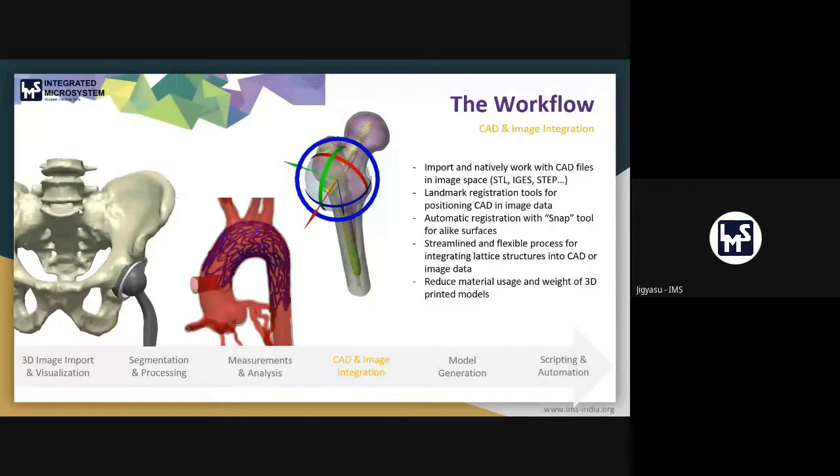Another very helpful thing is we can also design implants using third-party tools like SolidWorks in this part itself. So we can export our anatomy, let's say, taking the example of this pelvic structure. We can export this complete model to SolidWorks, and then I have the actual measurements or actual size of this model in SolidWorks.